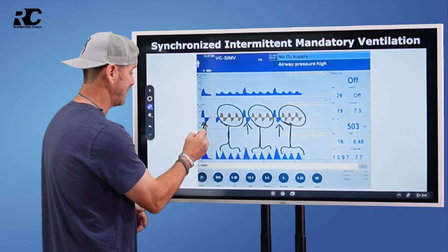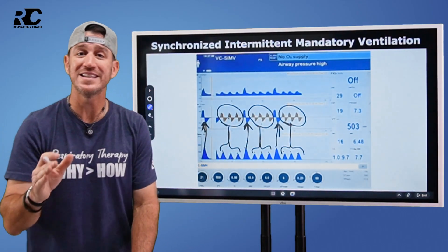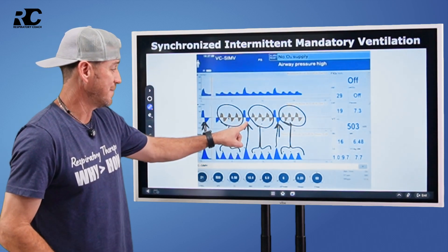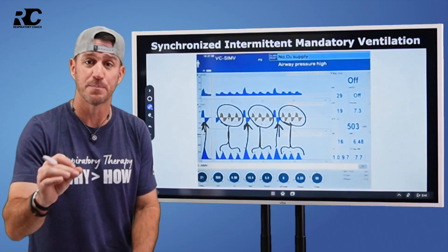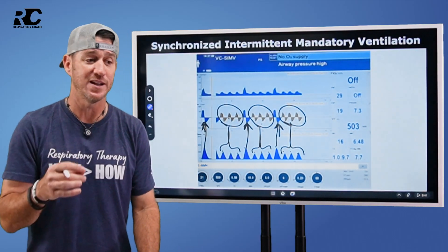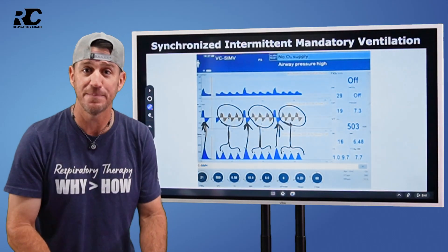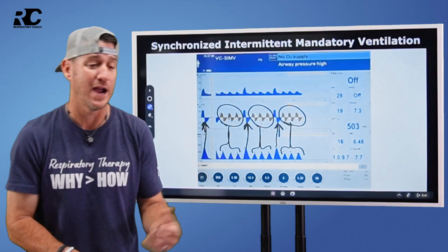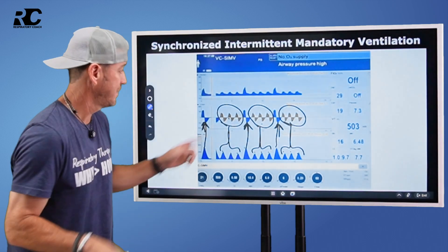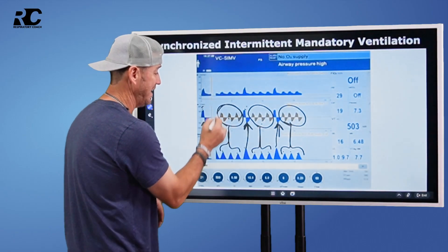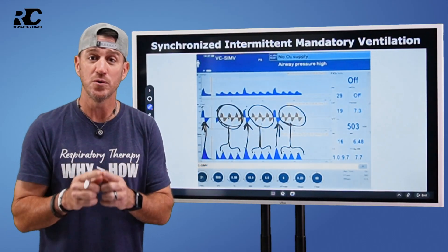These three breaths are identical, but the rest of them are different. The reason is that these are mandatory breaths — this is a mandatory breath, this is a mandatory breath, this is a mandatory breath. The rest of these are patient breaths. The patient said, I want to take a breath, and the ventilator said, cool. And because we're in SIMV, you can take that breath however you want to — however big, however small, however slow, however fast. The patient is in full control of that breath, which makes it a true spontaneous breath.